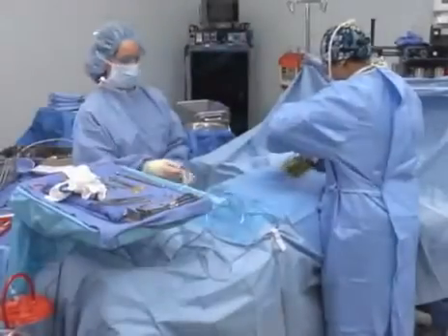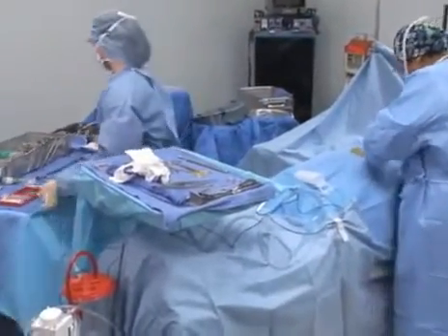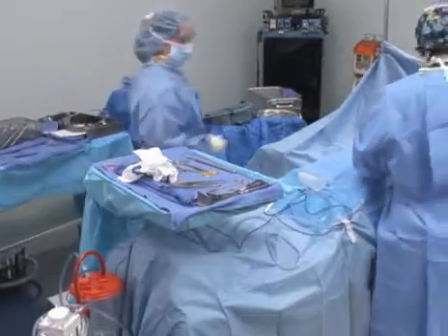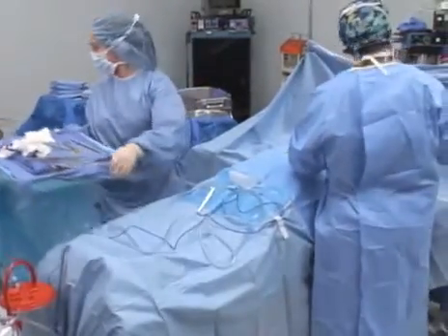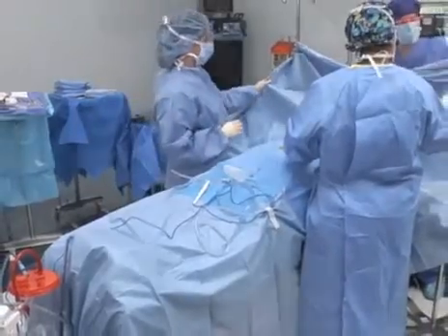Once the procedure is complete, all instruments and equipment are removed from the top drape, including the sterile portions of cords, tubing, air hoses, and other devices that can become tangled in the drapes.